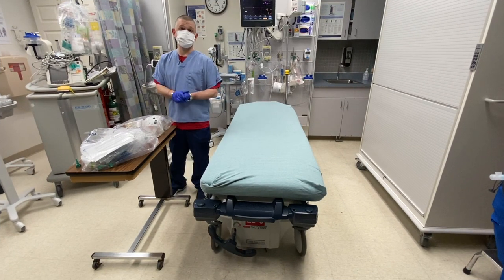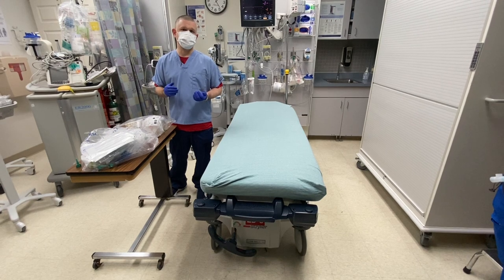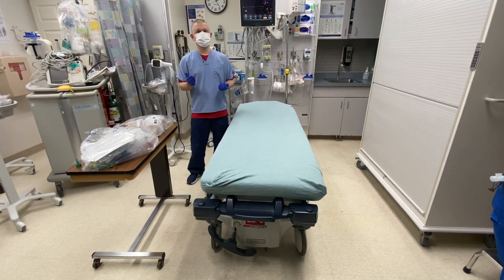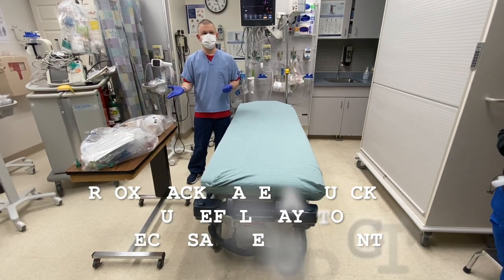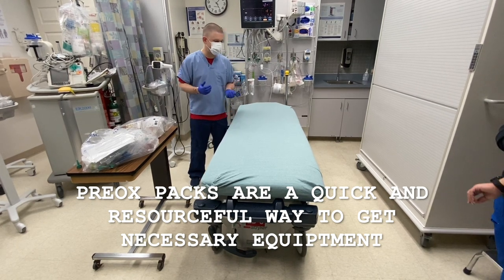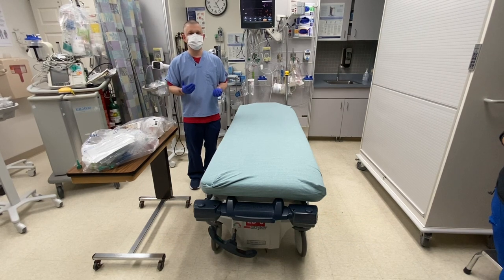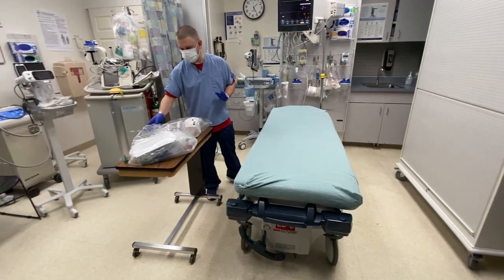So this is part one of the video series for the pre-oxygenation procedure on COVID-19 patients in respiratory failure. We're putting together these packs to facilitate the proper pre-oxygenation of these patients so that we do not contaminate with aerosolized particles. So let's first look at what is in the pack.